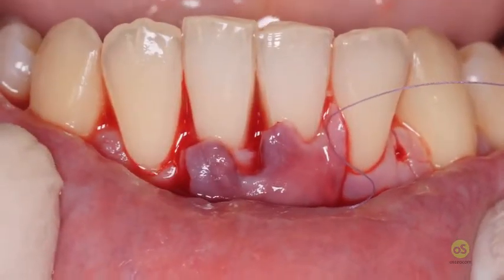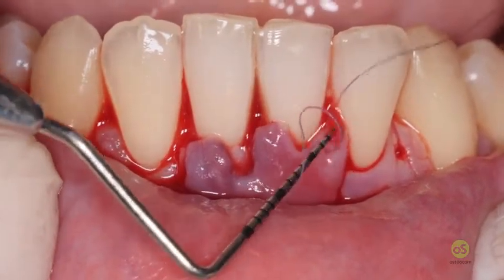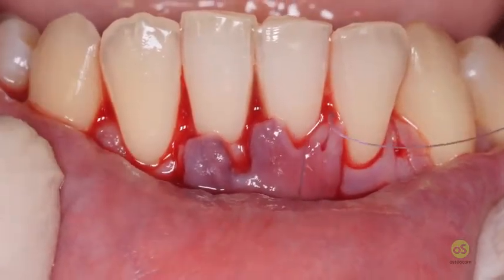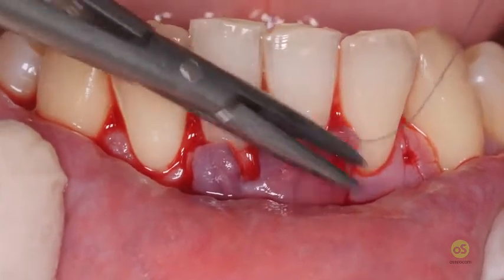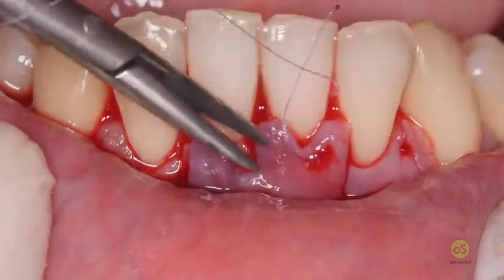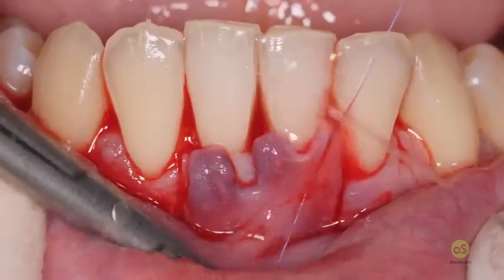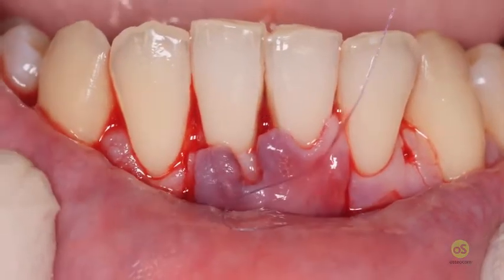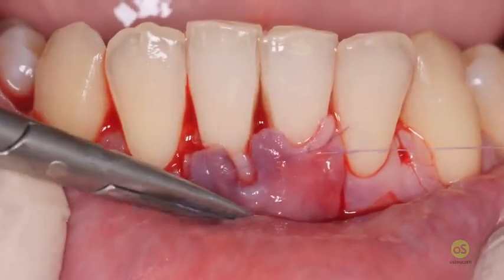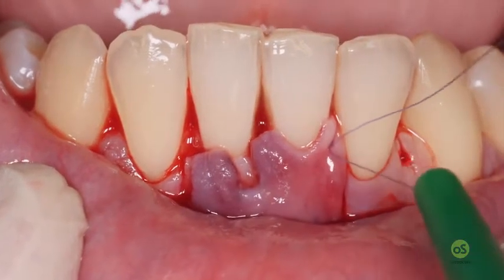It should be placed in the middle. I made a trapezoidal shaped papilla because I want to have this papilla in the middle more easily. So now the suture is in the middle.